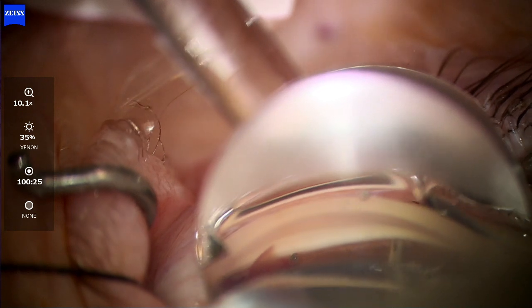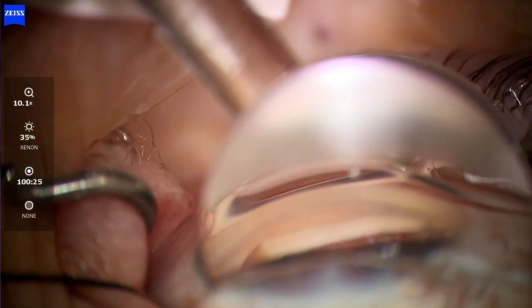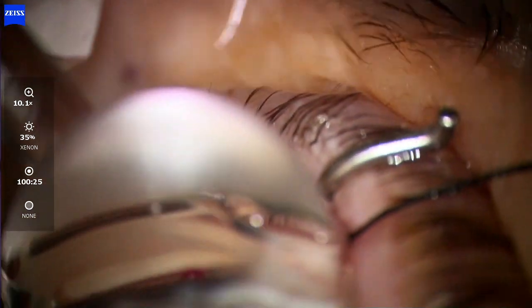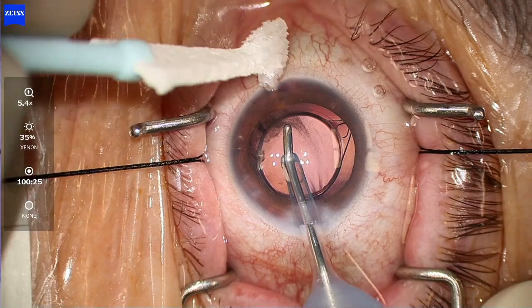After you put the first two stents, I actually move my scope and my chair a little bit so I can get to that furthest right stent as well. You want to try to get about two clock hours away between each stent — I'm not quite two clock hours away from each other here, but the idea is to try to be two clock hours between each stent to maximize exposure and contact with the collector channels as much as possible.